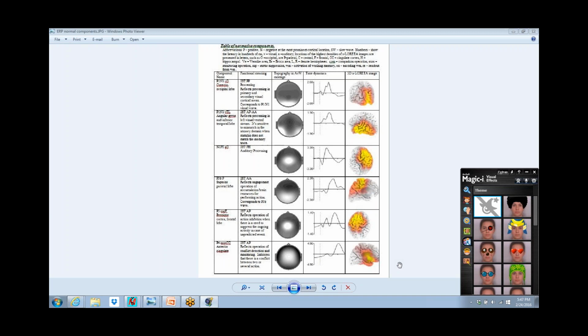ERP may assess the wiring, but the background state in the EEG is also extremely important. That's more fruitful for feedback from what we can see. The ERP is much more fruitful for diagnosis. If you punch in event-related potential and diagnosis, you get a much bigger yield online than if you punch in QEG and diagnosis. And half the QEG and diagnosis things, they're arguing against it. So, the incidence isn't exactly the only way to look at it, but the ERP is very well accepted across a lot of areas for diagnostic application. The EEG, QEG is still arguable in a lot of areas.